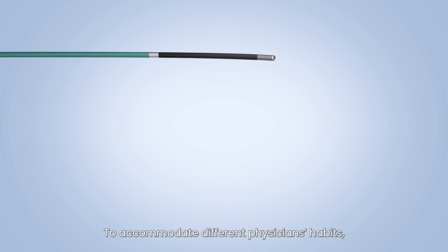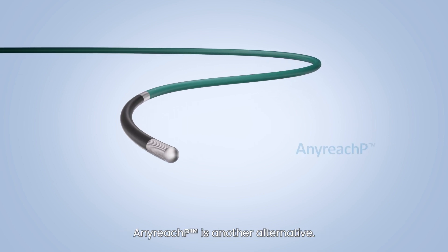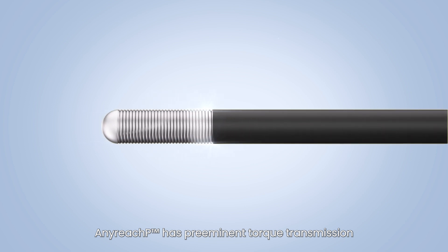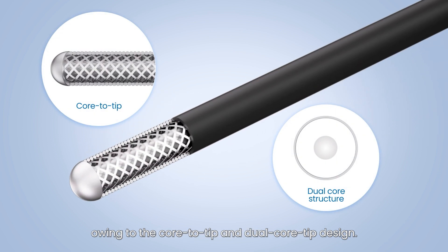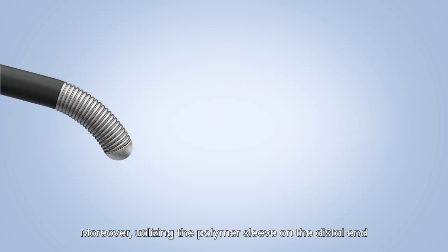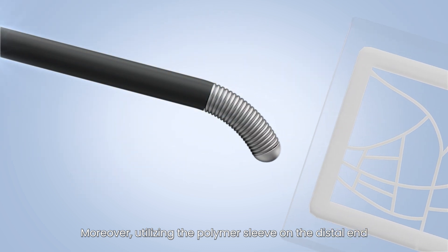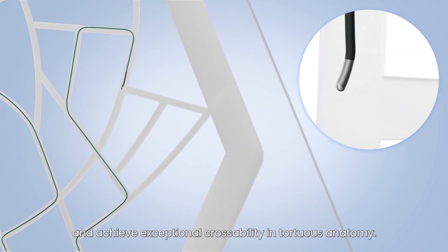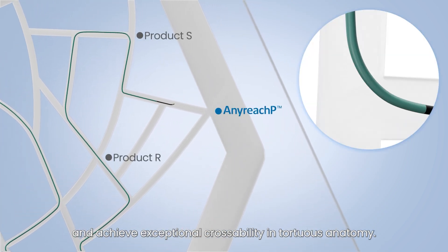To accommodate different physician's habits, AnyReach P is another alternative. AnyReach P has preeminent torque transmission owing to the core-to-tip and dual core tip design. Moreover, utilizing a polymer sleeve on the distal end with hydrophilic coating can greatly minimize friction and achieve exceptional crossability in tortuous anatomy.